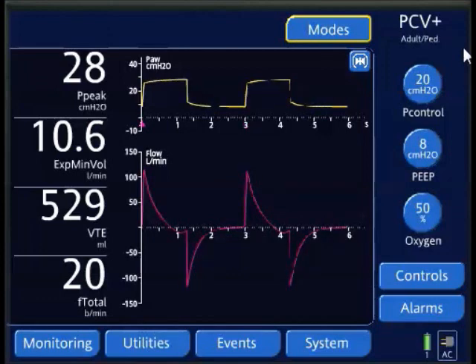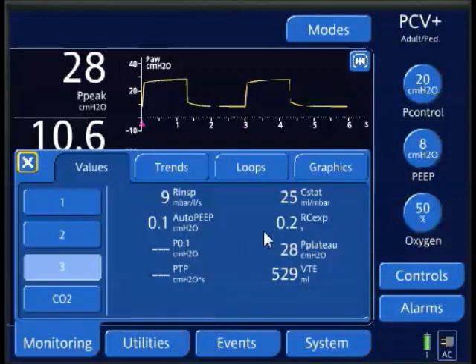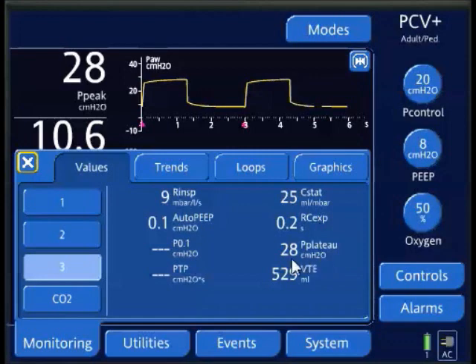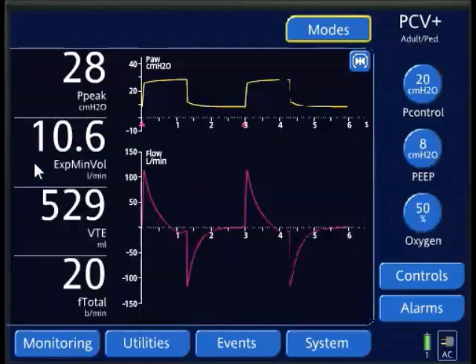which is the ideal way to get a plateau measurement. I can look under monitoring, and I can see right here, I'm kind of moving my cursor around, and you can see the plateau pressure is 28. But this is just a measured value, it's not a true value.